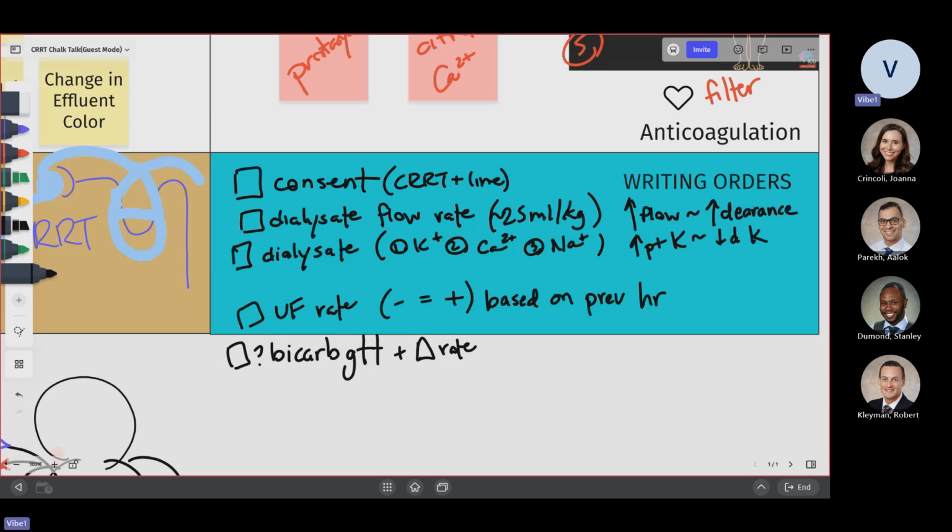So I'll check that out, but usually with the CRRT, we prefer on those ports not to run anything else, but there's a possibility you can use it post filter because you're not actually affecting anything. So that is something I'll look into this week and see what it is. Yeah, I've used it post filter before. It's just making sure that the nurses are comfortable doing it.